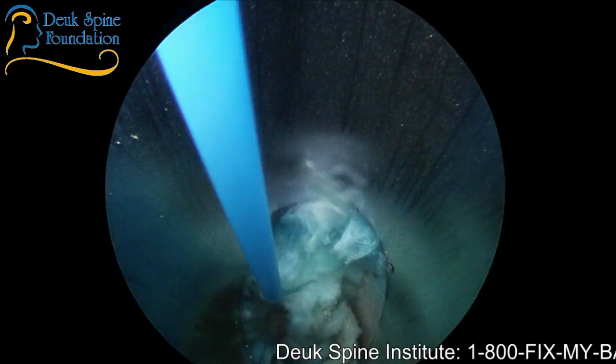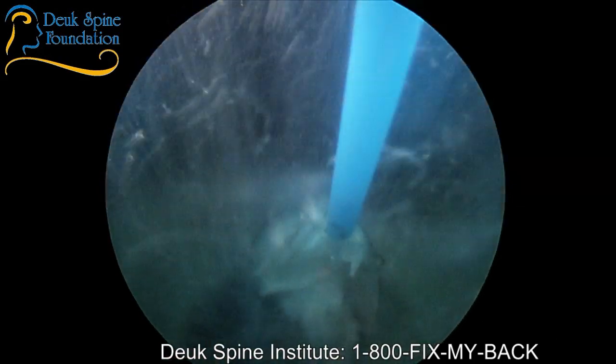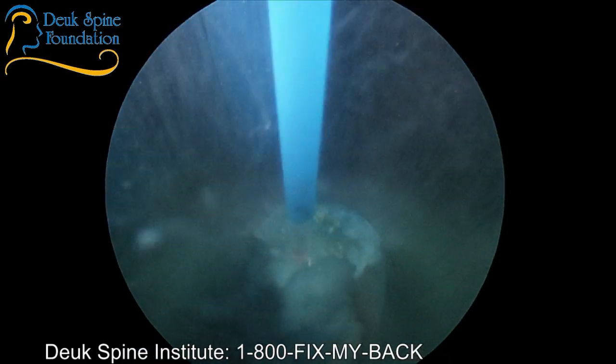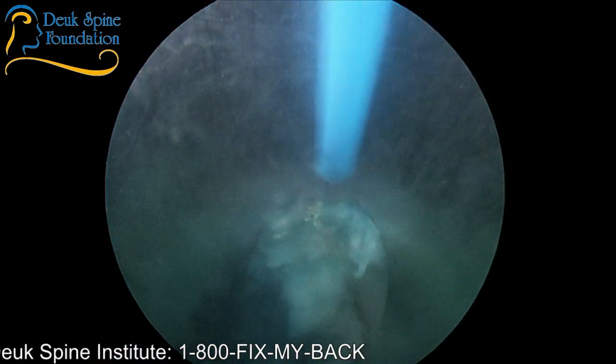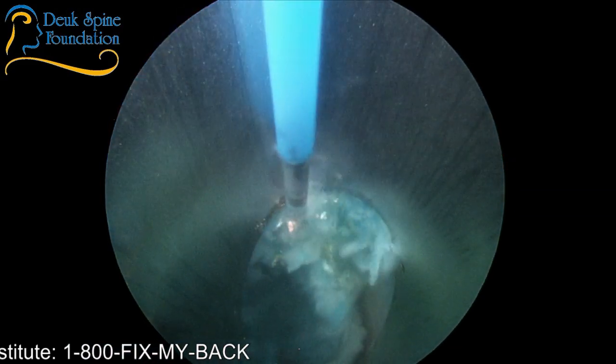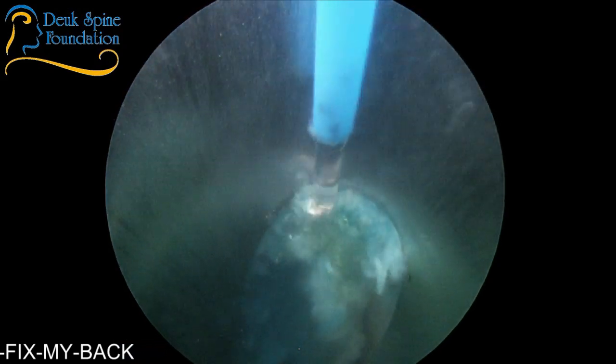Big, big tear. Now remember, this disc was not so painful for him in terms of axial pain, but it was pinching his nerve. And so this is more of an unpinch-the-nerve level rather than a get-rid-of-the-back-pain and debride-the-annulus level.